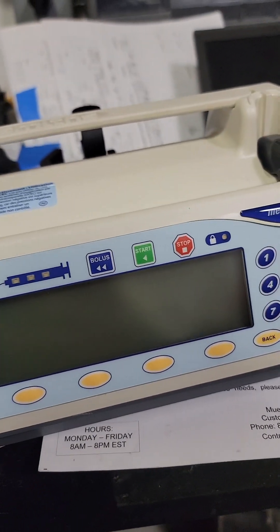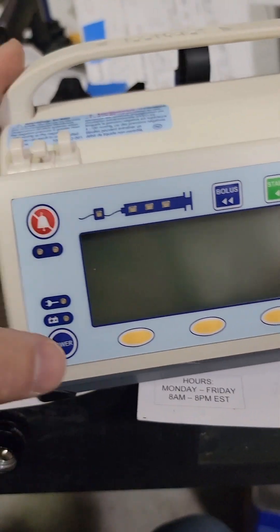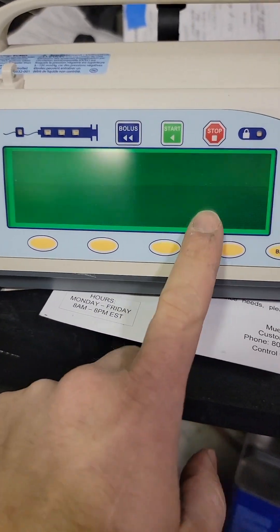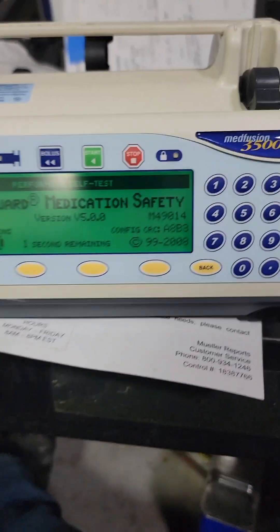The first test we're going to do is the cal size and position. Power it on, let it boot up. You're going to have a software version over here that is important as far as recalls go — there's a shared number, there's your version.